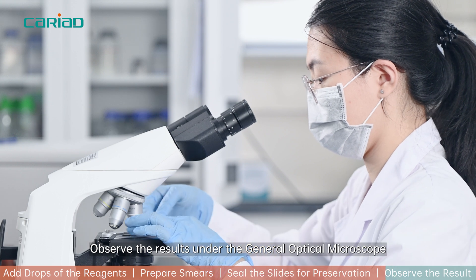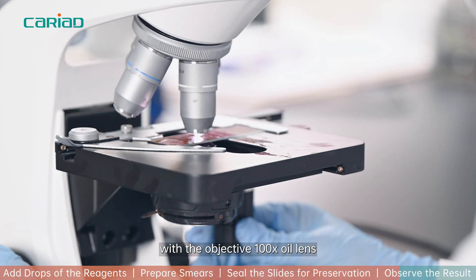Observe the results under the general optical microscope with the objective 100X oil-immersion lens.